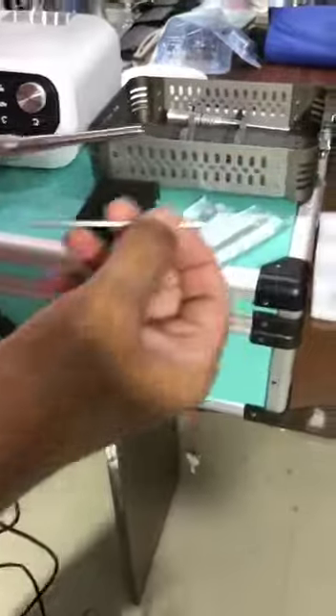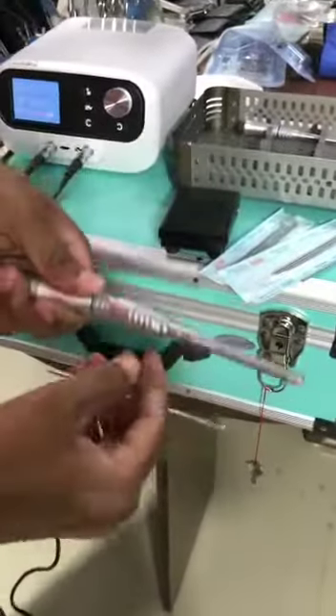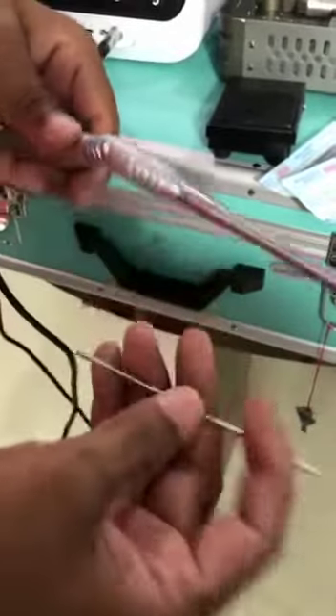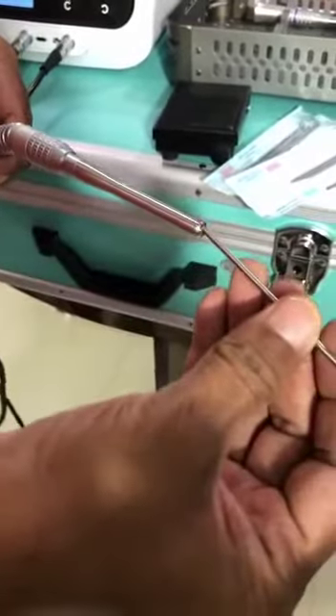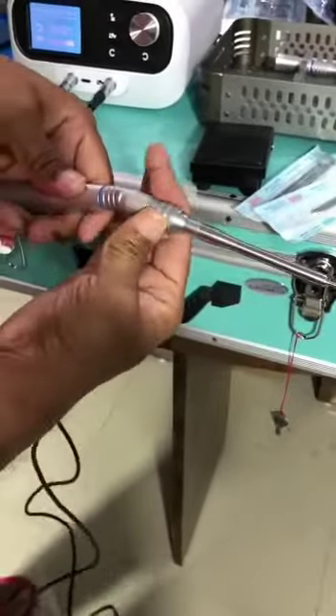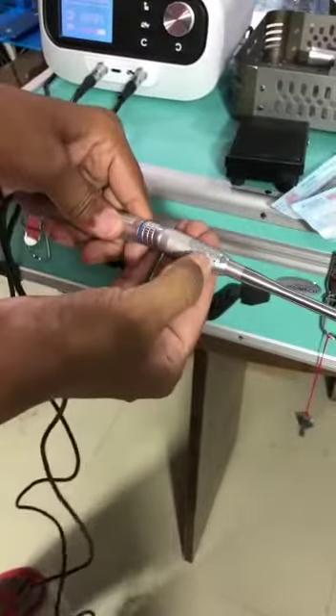We have to explain: this is an indication to open, and this is closed. Let's rotate this bar like this. Now just rotate this. Now this is closed.